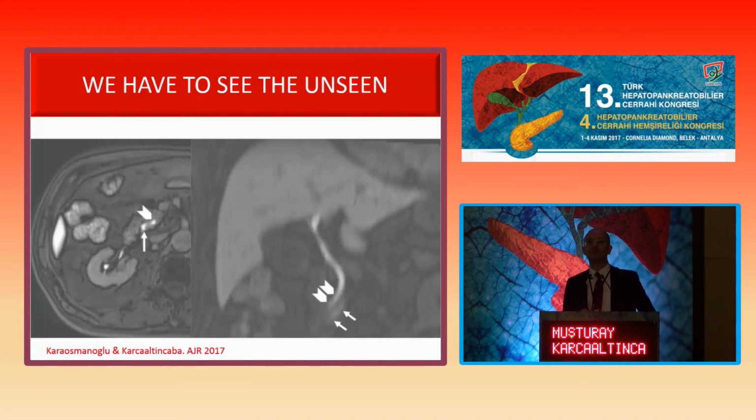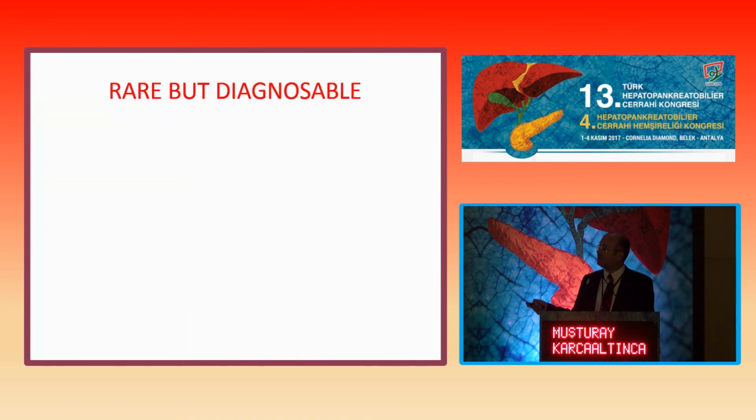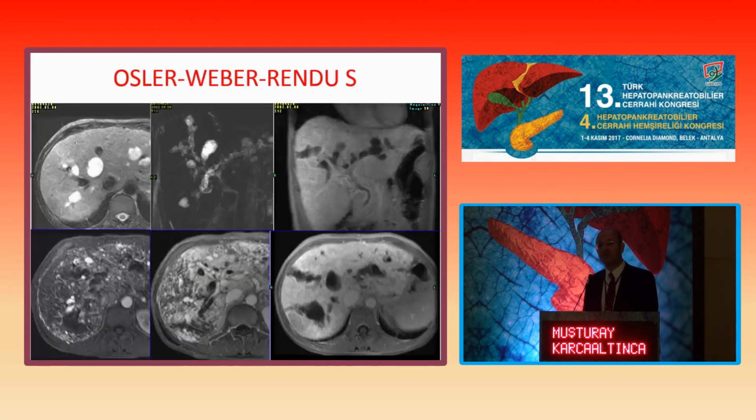And also, this was a recent observation that we published. It was really difficult for us to see the reflux from the biliary system into the pancreatic duct, but this was an incidental finding in our practice. We saw that the contrast was excreted into the biliary system, and you can see the reflux into the pancreatic duct. And actually, this was never shown by imaging, so this was the first patient that has been shown with this contrast agent.